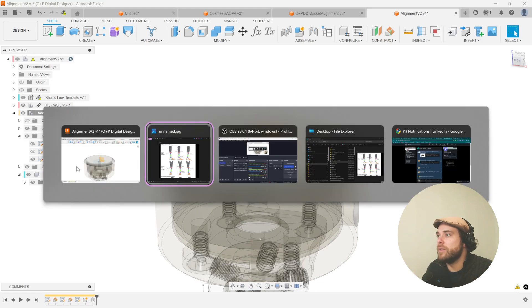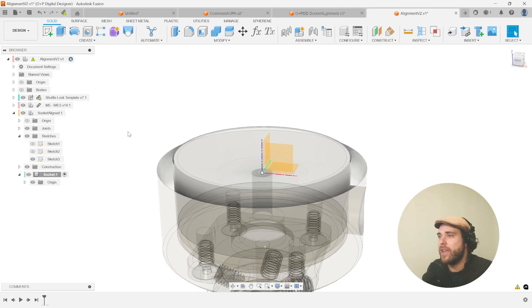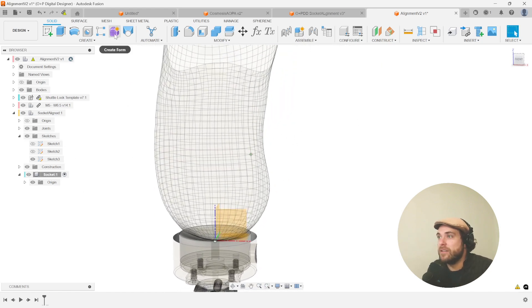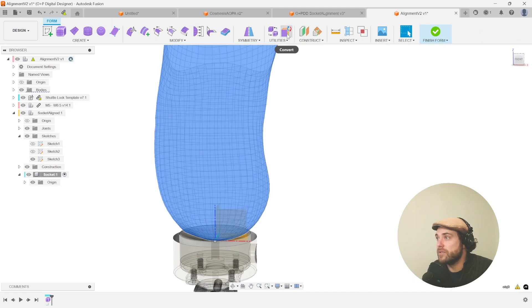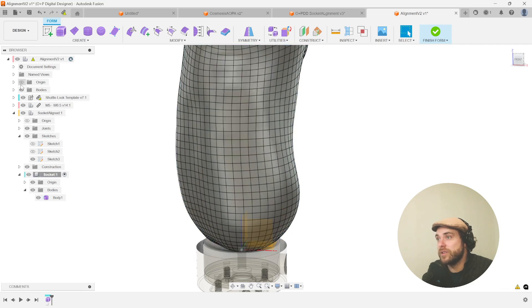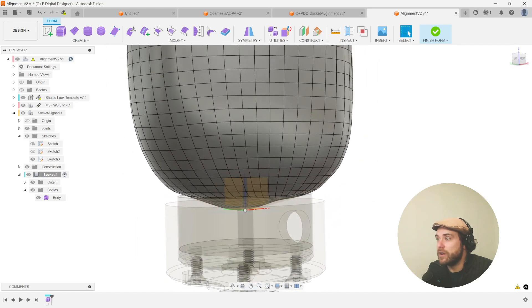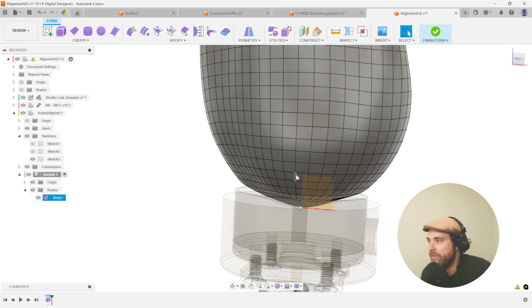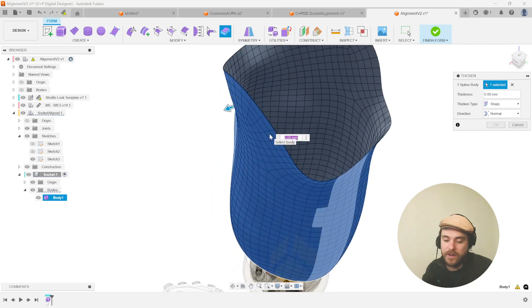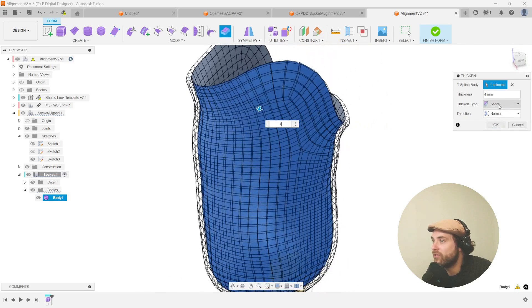We are now ready to do our alignment. Inside we'll hop into the component called 'socket.' Let's bring back our body from the root assembly and make that into a form inside our component — converting this to the quad mesh and hitting OK. That quad mesh is now turned into a spline body inside that container, so we can hide the initial mesh body. From here we're ready to loft down to this and do a quick thicken — let's thicken to four millimeters, keeping a sharp edge on top for now.